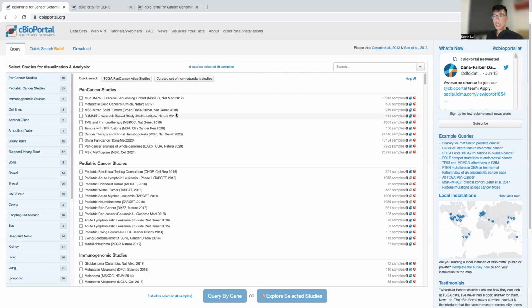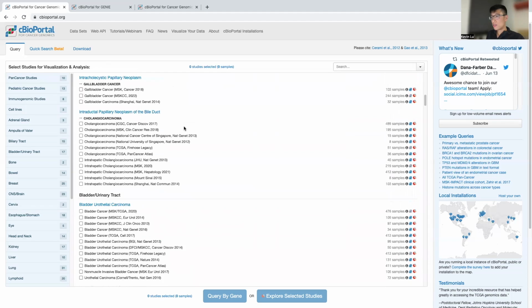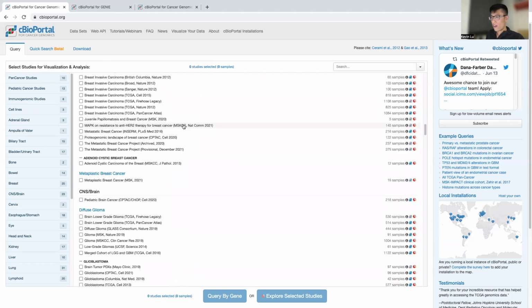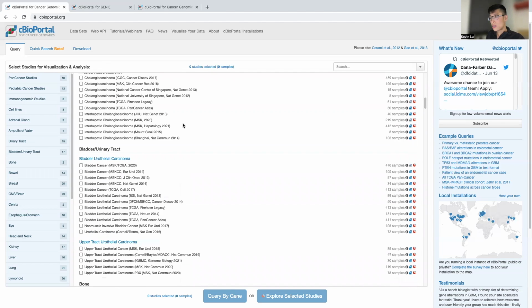And so this video is going to be a main overview of the types of cBioPortal and also how to navigate the main screen. And so as you can see, this is the main cBioPortal. I say main because I believe this is the first cBioPortal, and you can tell based on the amount of studies that vary between both solid and hematologic malignancies.